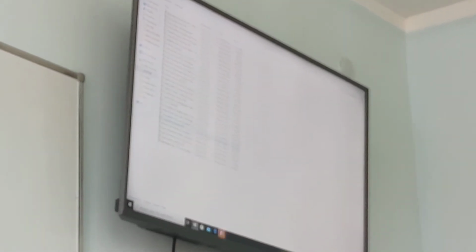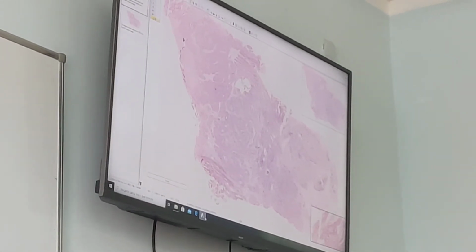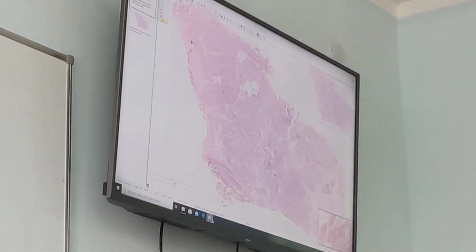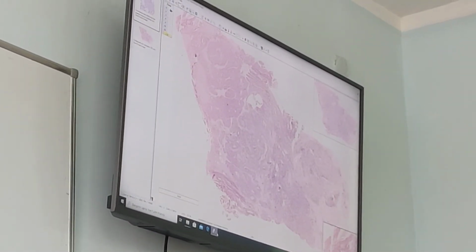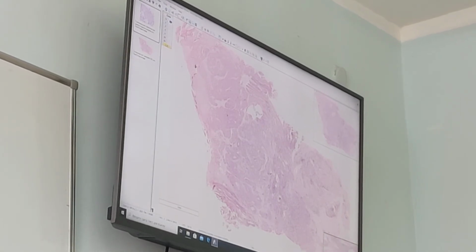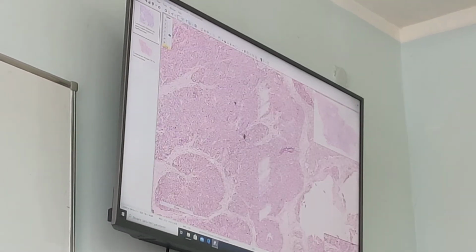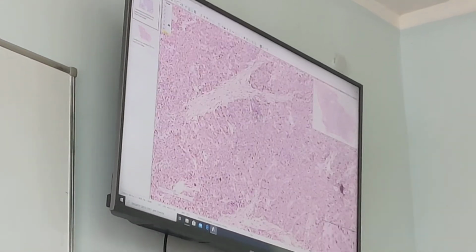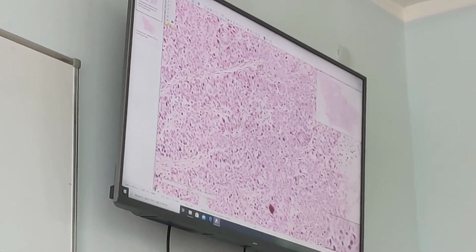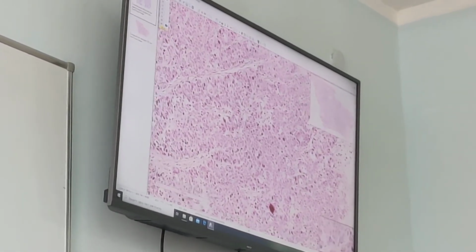Next one, solid cancer of the stomach. Solid means the tumor field is represented with a constituent space of tumor cells, a whole field without glands, without tubules, without papillae, without anything, just a field of tumor cells. What can we see? In the stomach wall, the area of cancer growth is represented by a whole mass of atypical tumor cells, both tissue and cellular atypism.